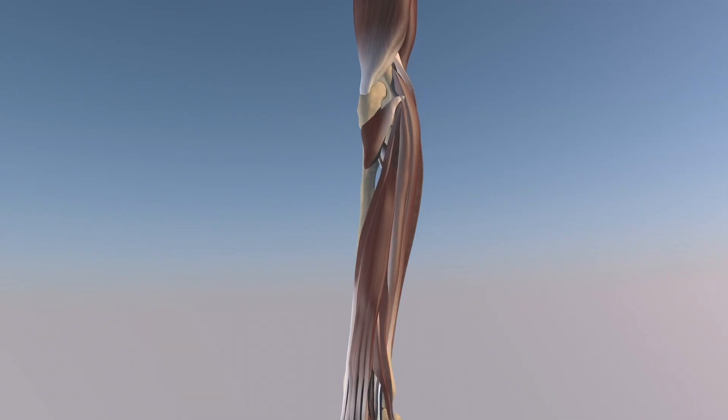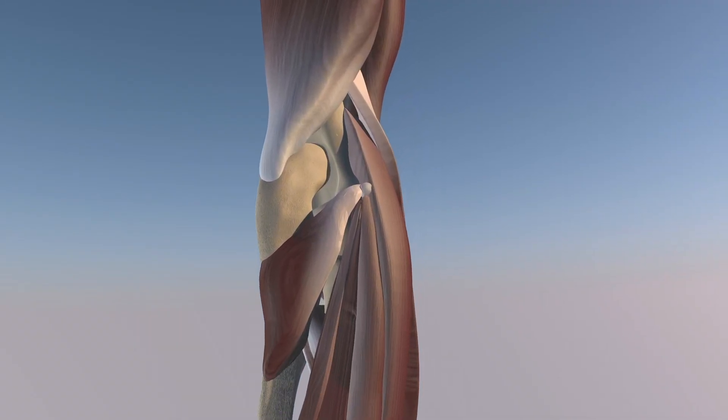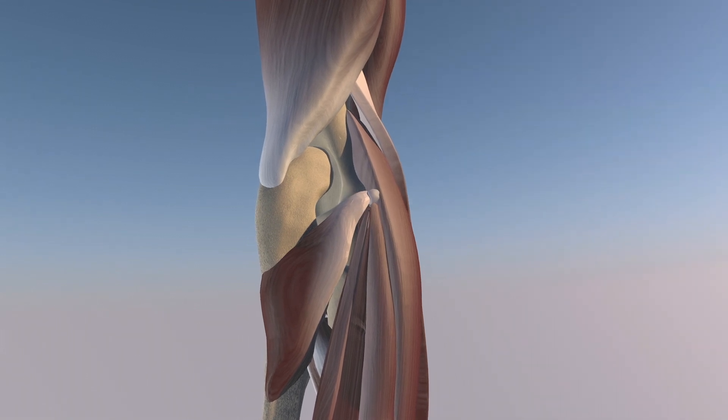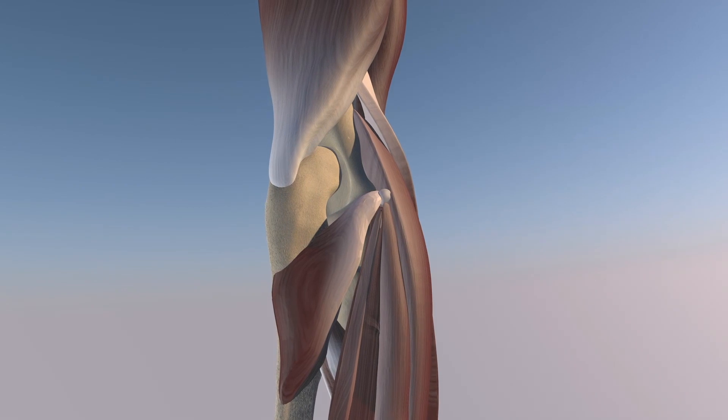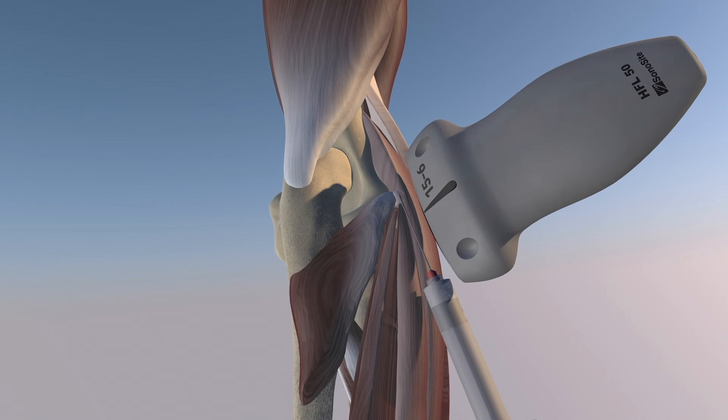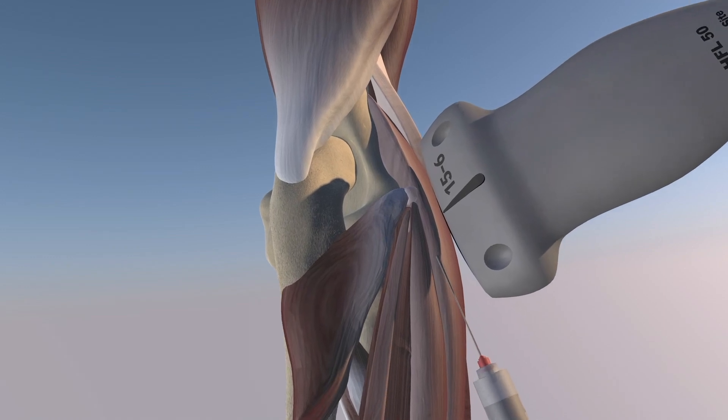Here we're going to go over a needle fenestration of the common extensor tendon and a post-traumatic ganglion right over the lateral epicondyle, which you can see here. We'll just rotate the elbow a little bit to get this ganglion in view a little bit better. And now we're starting this needle fenestration of the common extensor tendon, including this ganglion.